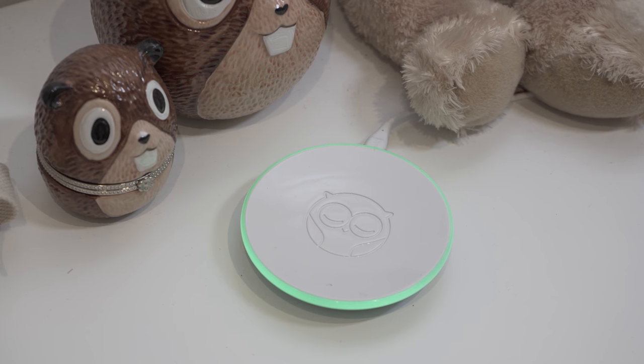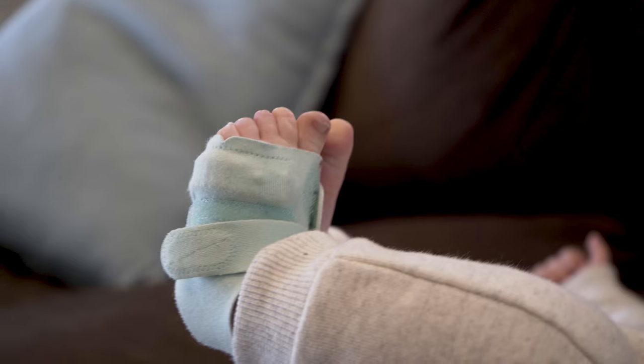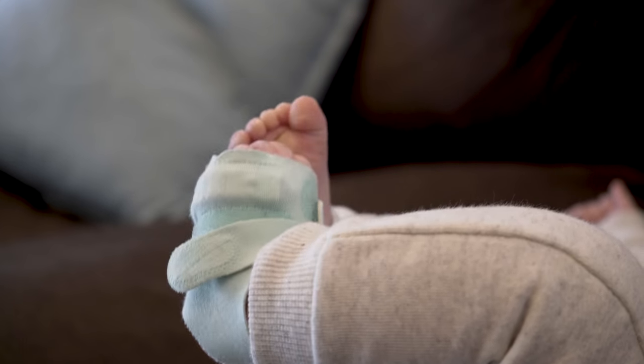The base station — I love the fact that it alerts you with colors and sounds if something's wrong. That's a feature I haven't seen in other products before.